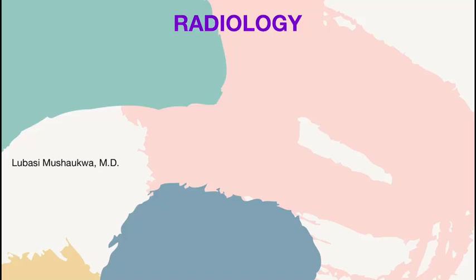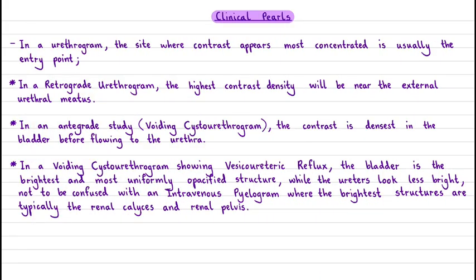This is part 3, and in this video we are going to focus on some of the most common urological investigations that you might find yourself needing to order. So let's get started. Before we start answering any questions, I would just like to introduce us to the various investigations that we're going to look at.